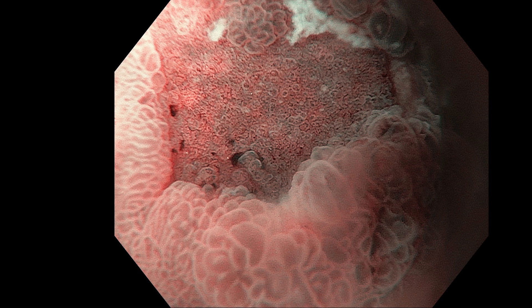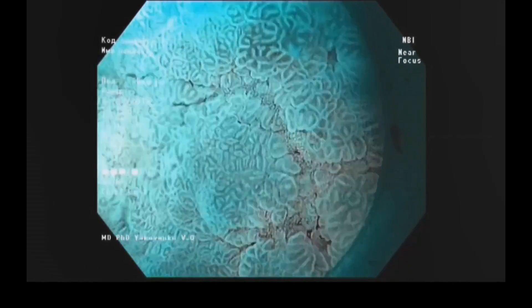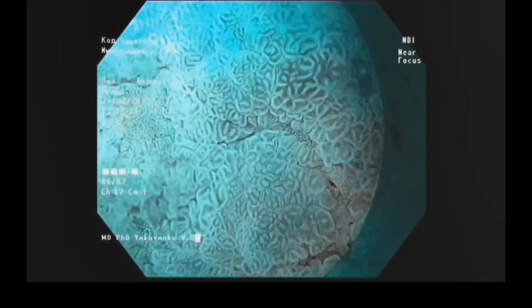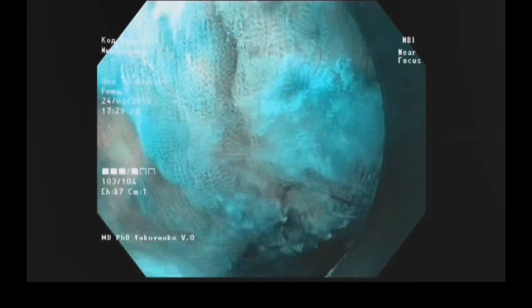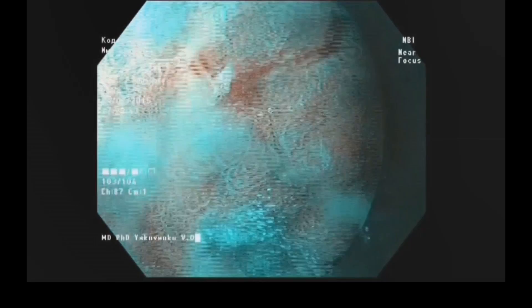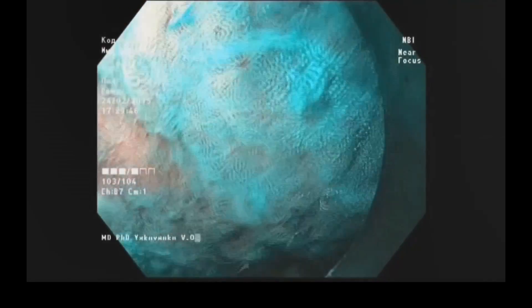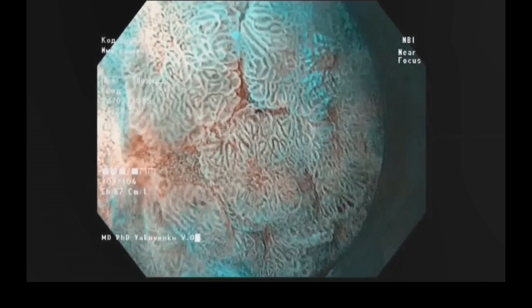With high magnification we saw a destroyed pit pattern. Then we used water jet magnification. In this procedure, by water jet, we flattened the mucosa. At 9 o'clock where the jet was presented, we see the real body of the lesion — something wider than before the water jet procedure.